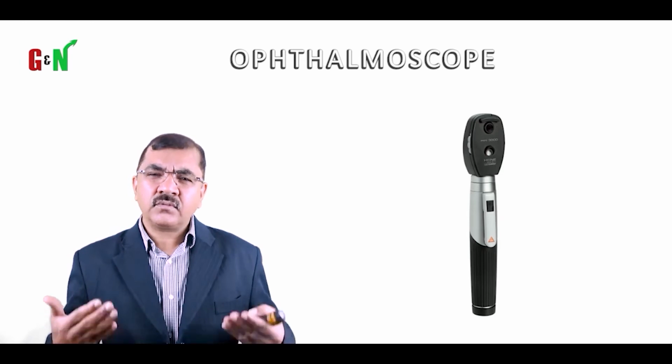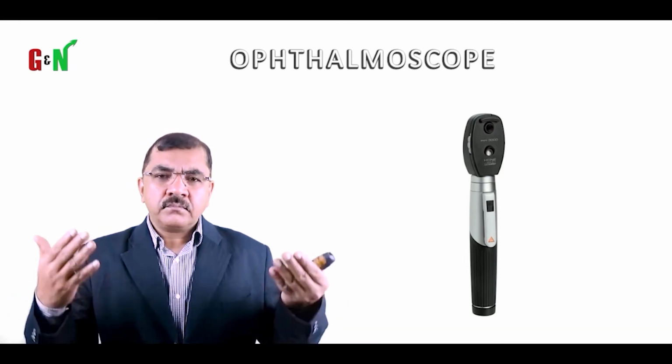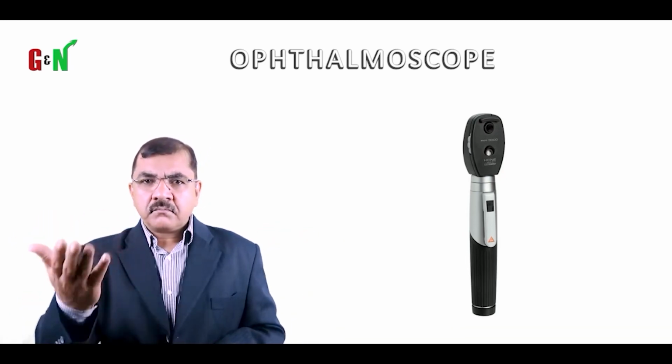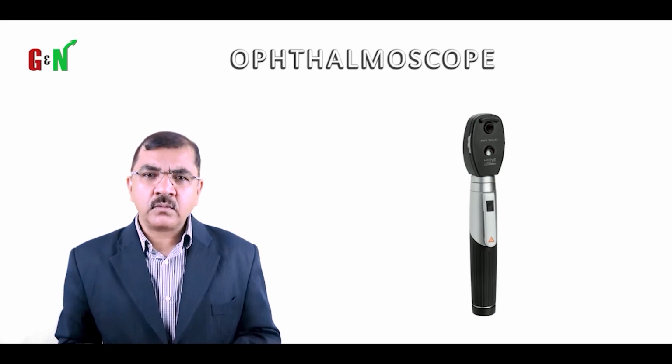They are able to look into the disc. Maybe if the patient has diabetes, all those wonderful things can be looked at through the ophthalmoscope.